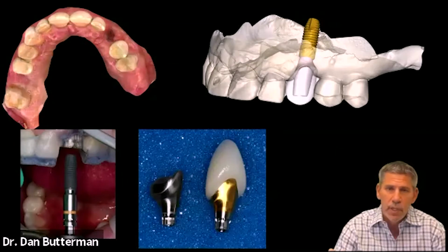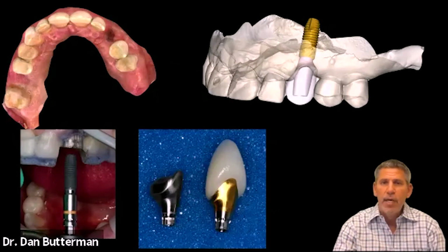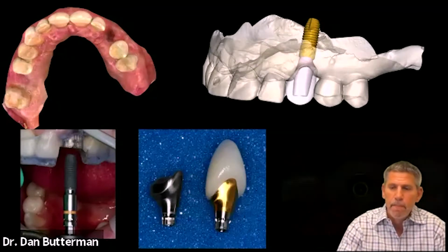So if you're going to put something on the day of surgery, why not have something that's exactly the shape and contour of your final restoration? That's the premise behind having a custom healing abutment.